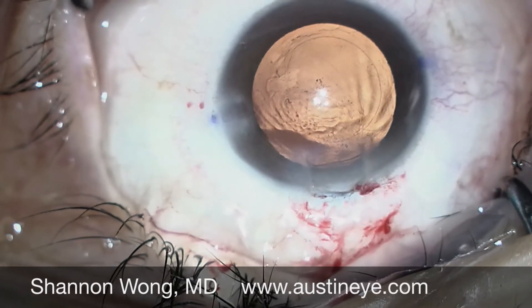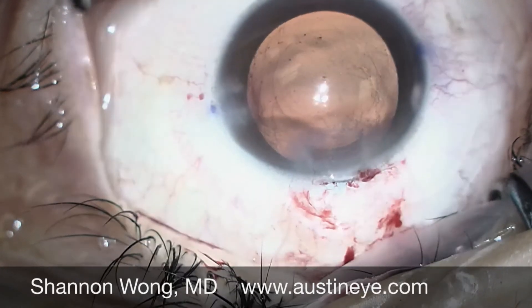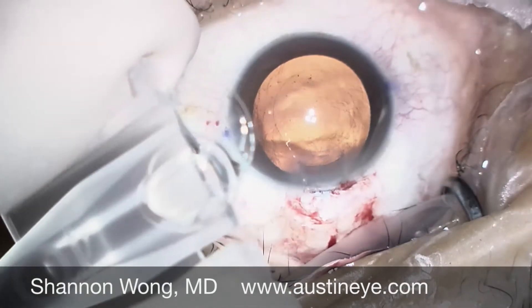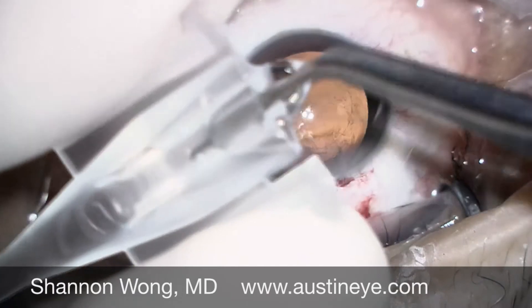This technique allows us to not have to cut the entire diameter of the lens optic. We then take our replacement toric lens and insert it into the cartridge in the usual manner.